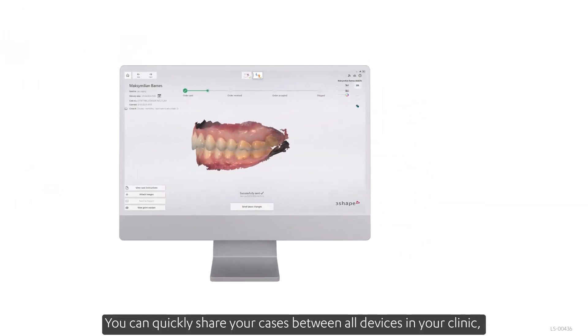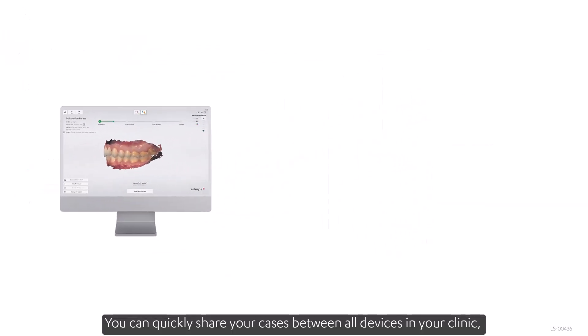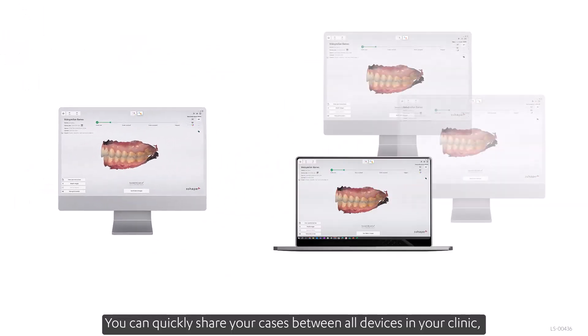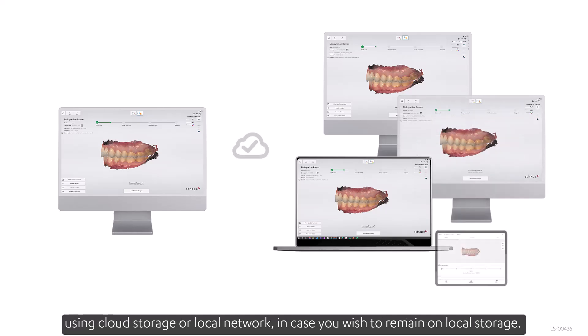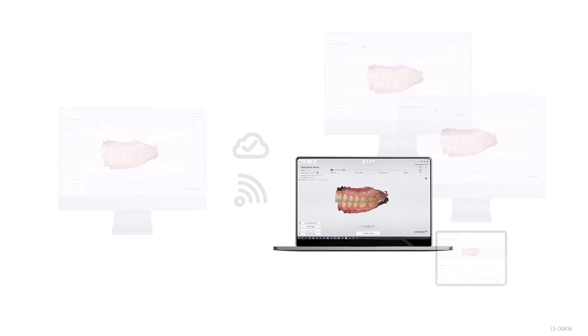You can quickly share your cases between all devices in your clinic, using cloud storage or local network in case you wish to remain on local storage.